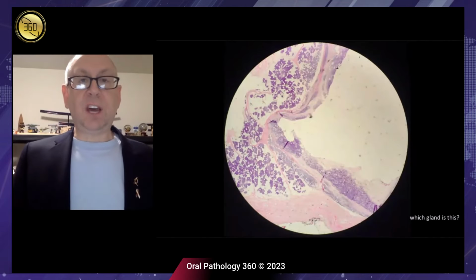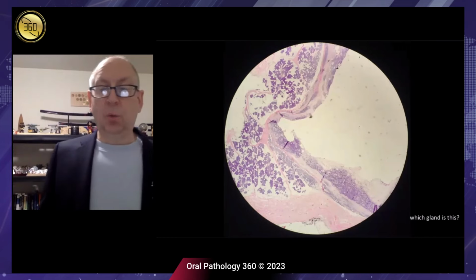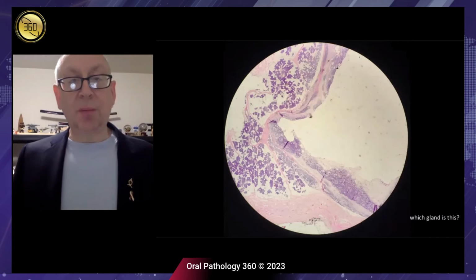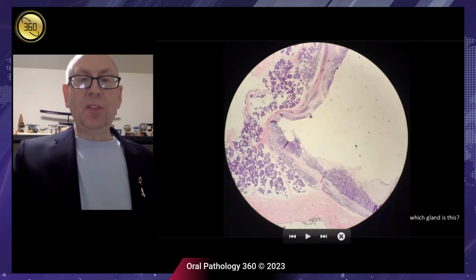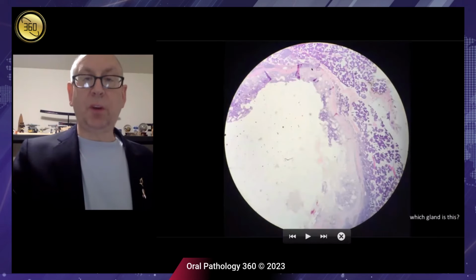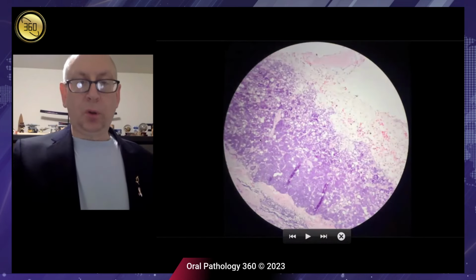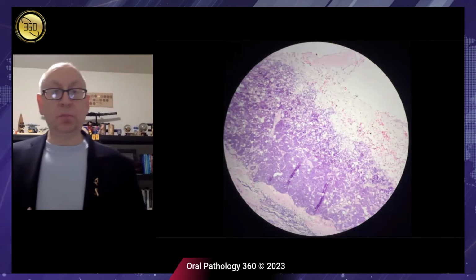The second is a salivary gland mass that's going to bear strong similarity to this case. Once again, I can ask my learners which gland. So I have gland admixed with a lot of adipose tissue. I'll tell you we're in the parotid gland. And again, I have this very cystic tumor that seems to be fairly well contained away from the inked margin. All the way around, it seems to be fairly well encased within this somewhat capsule. When I start looking at higher power, now I'm seeing this tumor looks much more basophilic.